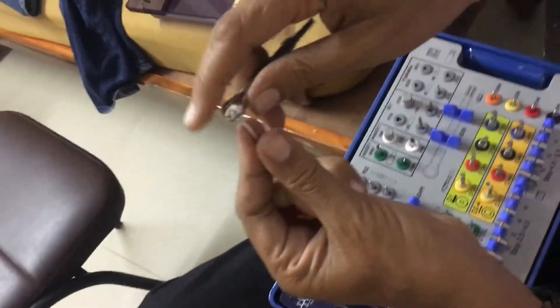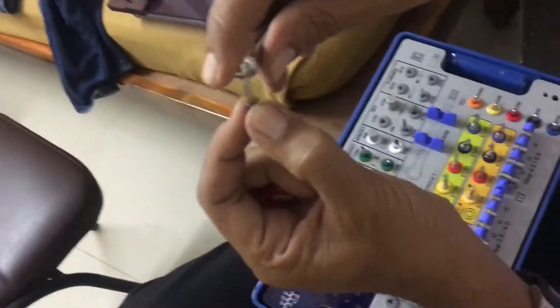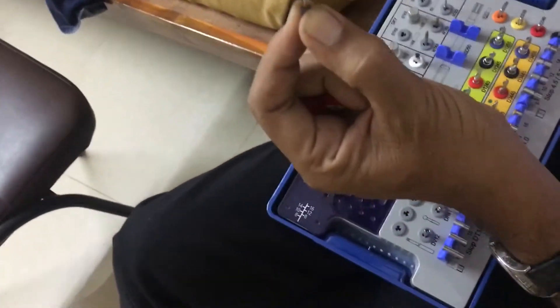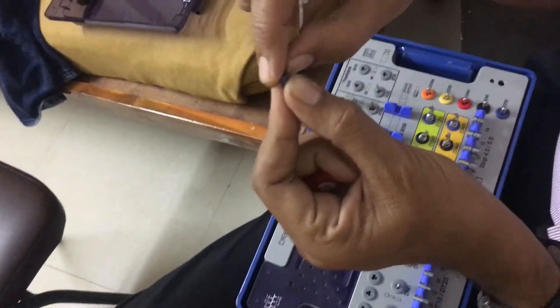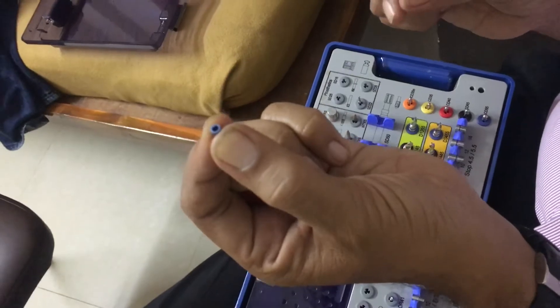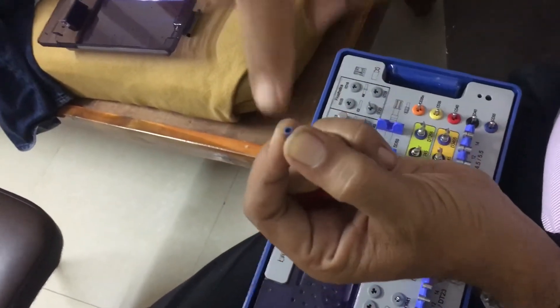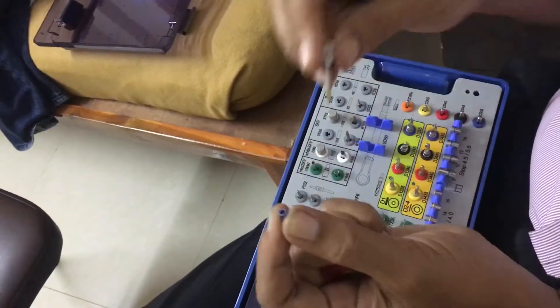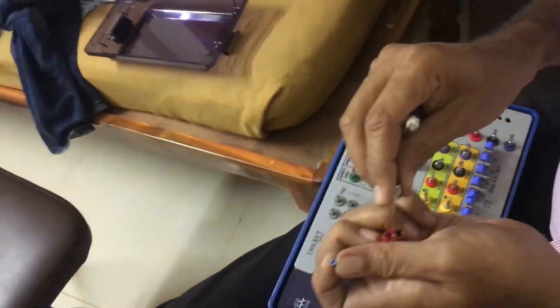Now you have to see that the implant and the bone are at the same level. Fix it properly — there should not be any threads visible outside. The threads should be completely buried into the bone. So you have completed the procedure of implanting.